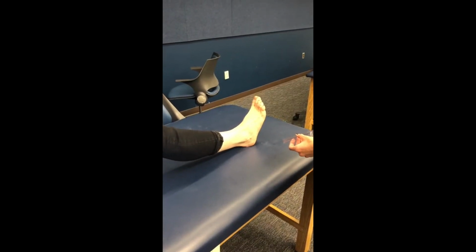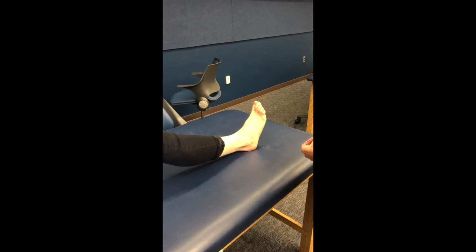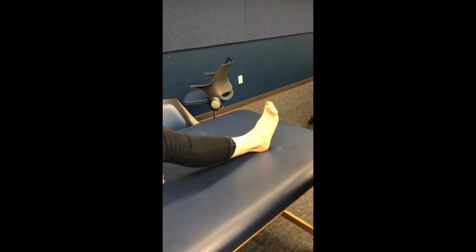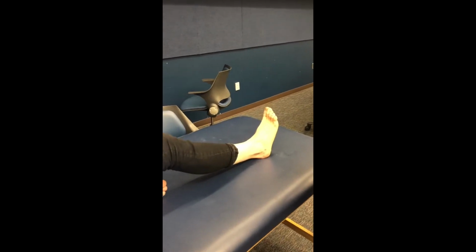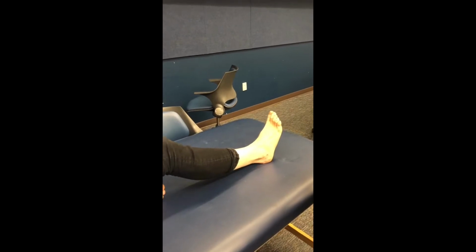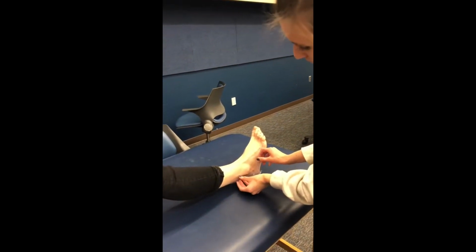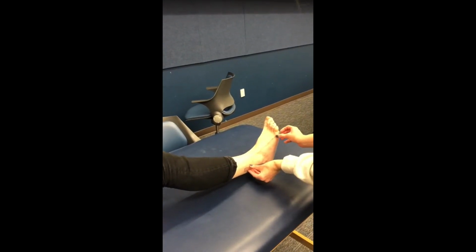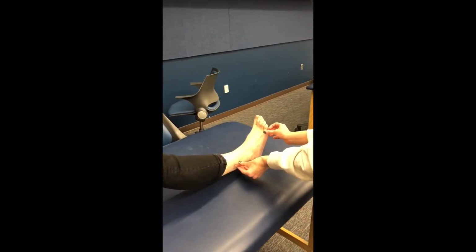Ankle goniometry, ankle plantar flexion, 0 to 50 degrees. Position of client, supine or seated with knee flexed at least 30 degrees, ankle at 90-degree neutral position, and foot in 0-degree inversion and eversion. Position of the goniometer, axis below the medial malleolus, stationary bar parallel to the longitudinal axis of the tibia, movable bar parallel to the first metatarsal. Client will plantar flex the foot.